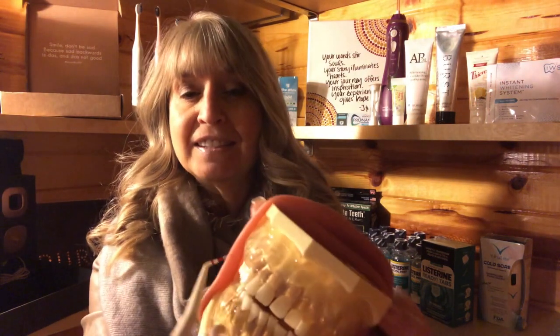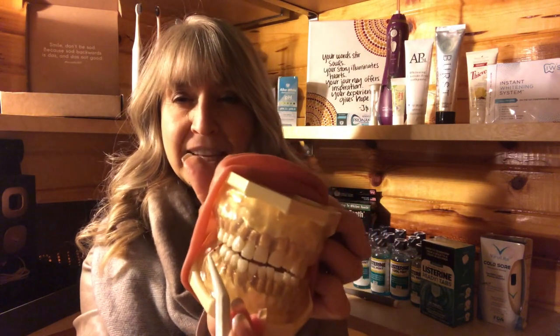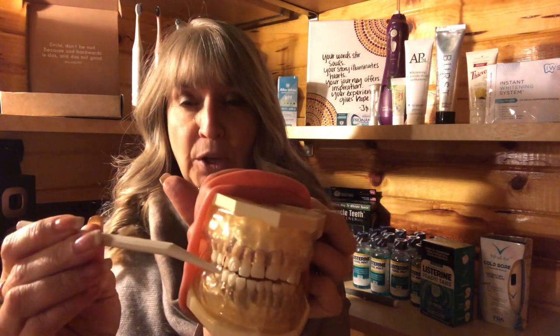Today's video, know your numbers. So what does that mean? As a dental hygienist, we use a tool called a periodontal probe to measure the gums. What that does is take little measurements in millimeters to measure below the gum line to see how healthy your mouth and gums are.